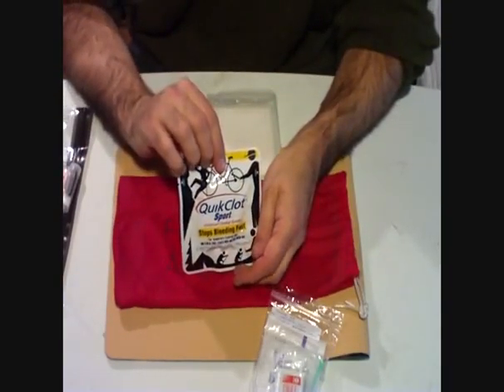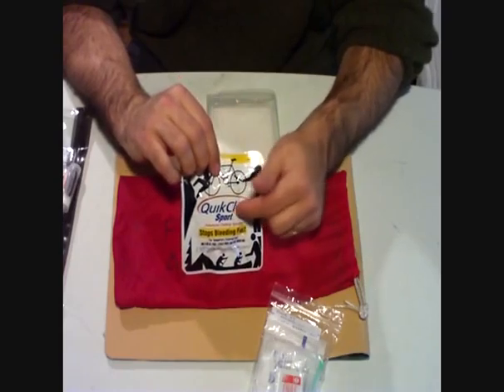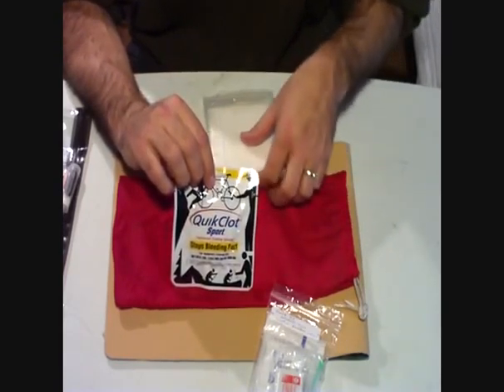Quick Clot — ten dollars. So actually I said ninety dollars total before — I forgot about this. This is another ten bucks just for this one thing right here.